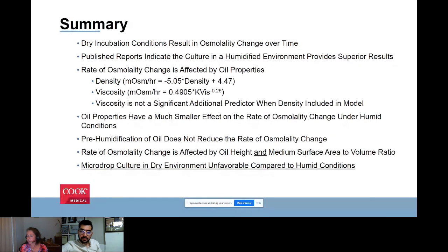How were they cultured, droplet or large volume? I can actually tell you that. The first paper was done in the Geri, so that is 80 microliter, I believe. From memory, I think you can put in up to 4 ml of oil in the Geri, which is quite a high volume of oil. The second abstract was also done in the Geri, so same amounts. And the third one, they were 15 microliter droplets under 5 ml of oil.